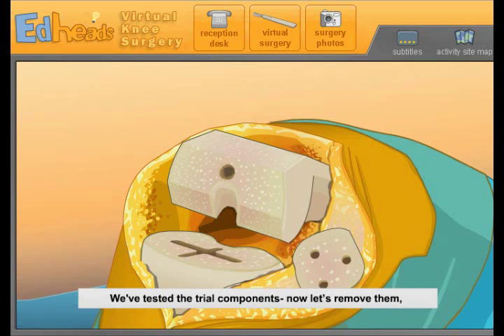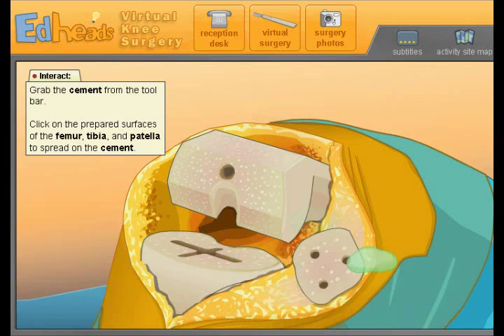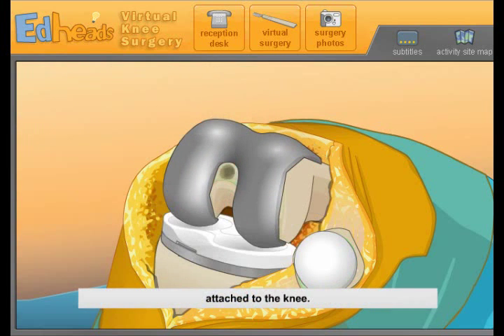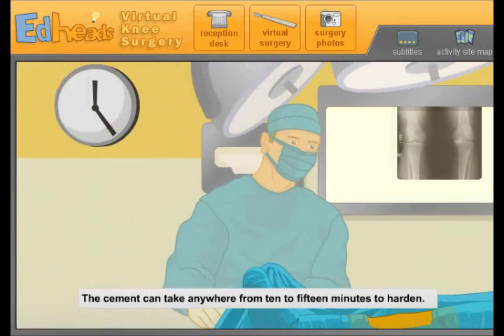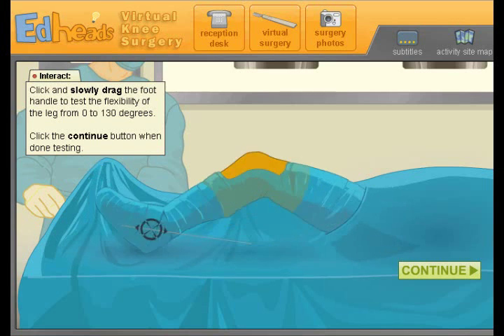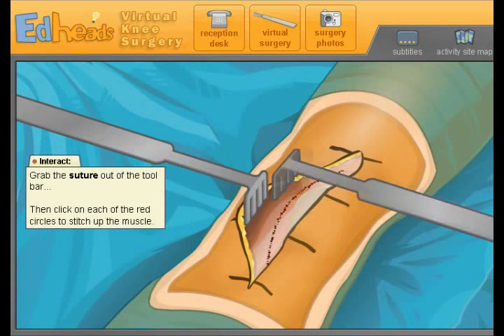We've tested the trial components. Now let's remove them and prepare for the permanent components by applying a special cement compound that binds metal and plastic to bone. A scrub technician has mixed up a batch of cement for you to use. With the cement in place, the final components are permanently attached to the knee. Any excess cement will be scraped off. Lay the leg flat on the table so the new knee components put pressure on each other — this allows the bone and components to bond. The cement can take 10 to 15 minutes to harden. We perform our range of motion test one final time — our patient's new knee is looking good.